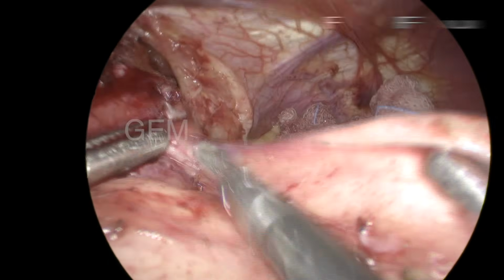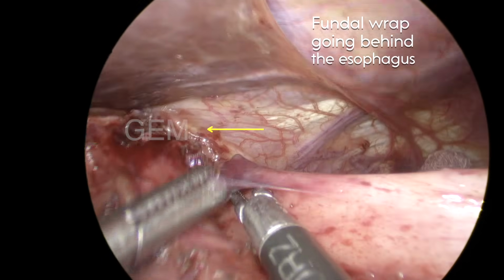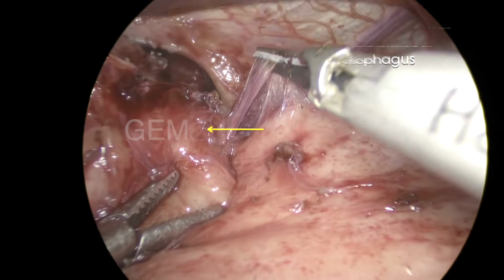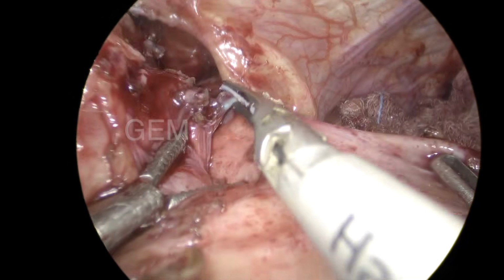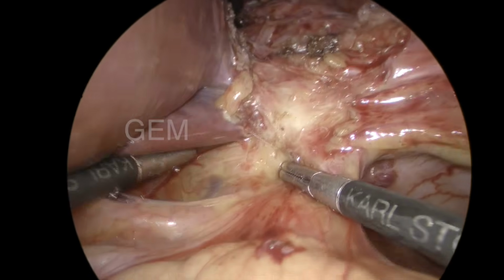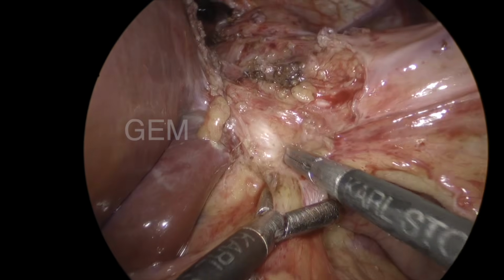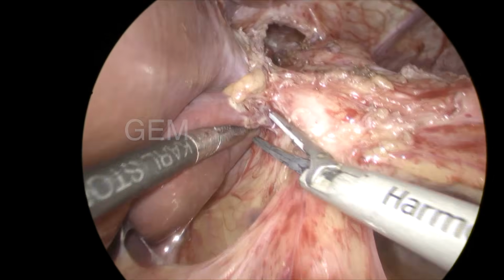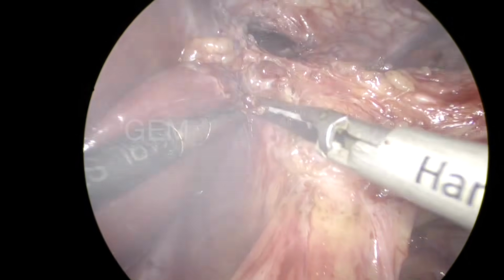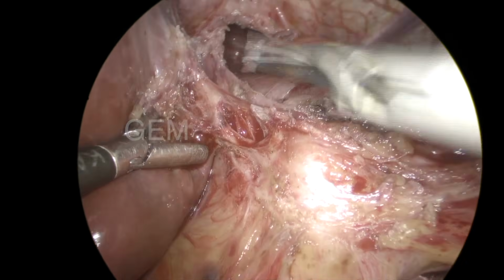Now you see the fundus is going behind the esophagus, the fundal wrap is going behind the esophagus. Again the suture is there, so many sutures. Usually even in a Toupet fundoplication, 7 sutures: 3 on the right side, esophageal wall with the fundus, 3 on the left side, esophageal wall with fundus, and 1 for fundal wrap to crus, only 7 sutures. So now again I am coming this side because the fundal wrap is going behind the esophagus. So that is the caudate lobe. From the right crus I am separating the caudate lobe. You can see again some suture is there, I am dividing the suture.